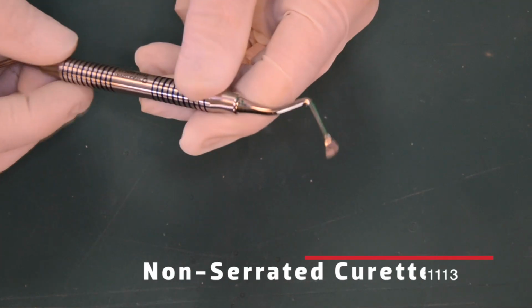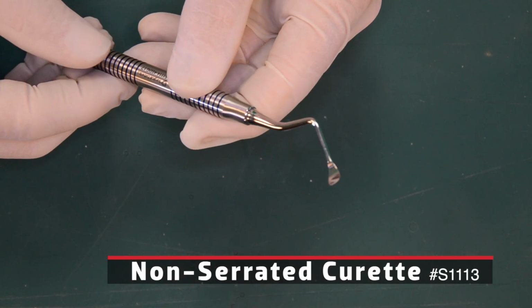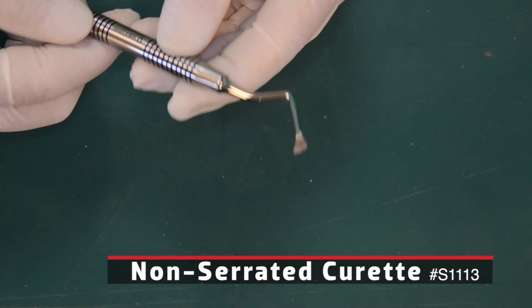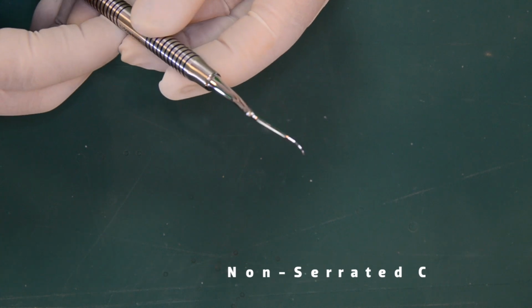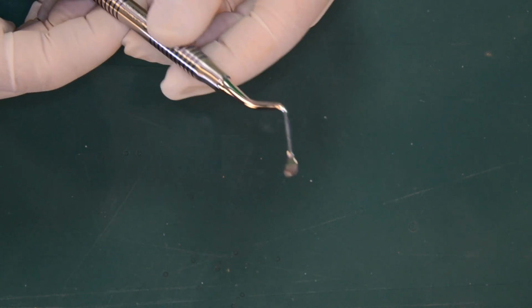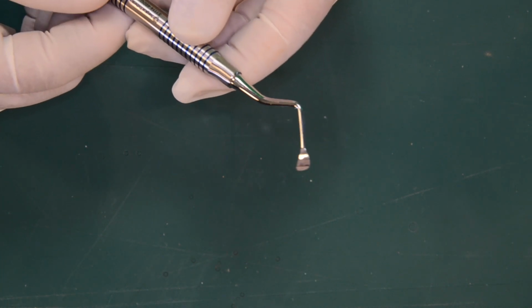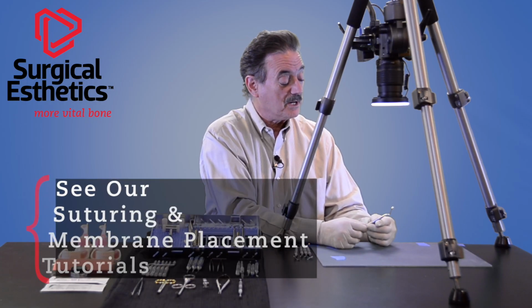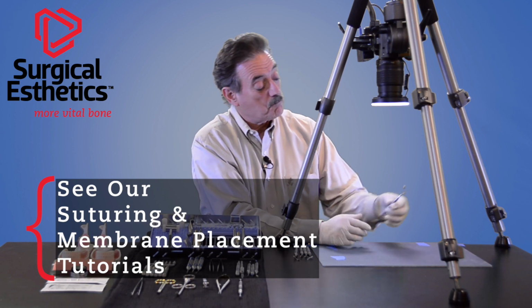So our next instrument is the surgical curette. This particular one has a smooth end, which is pretty typical for your curettes. We use this instrument more during suturing and membrane placement, and we'll talk about that when we talk about the technique videos.